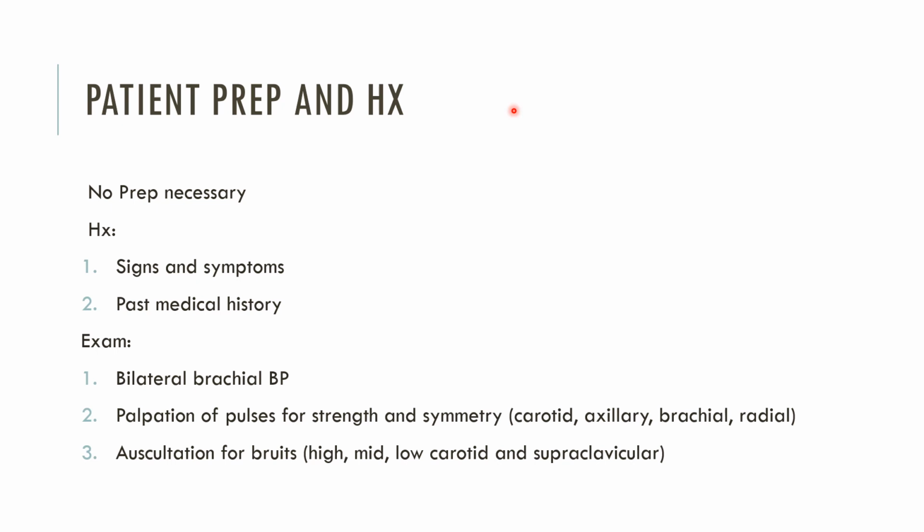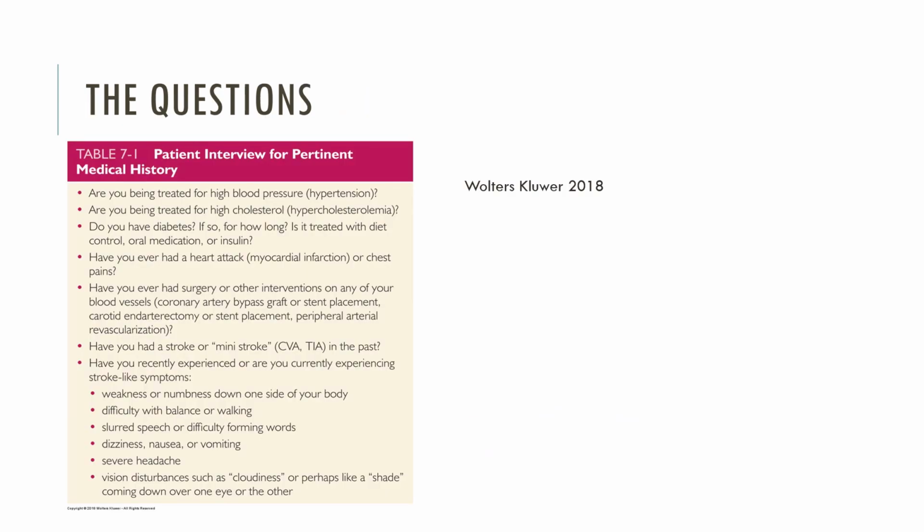One of the best ways to ensure that you're not forgetting anything is to make sure that you have a really good worksheet at your site. And having all of the signs and symptoms questions that you want to ask your patient, as well as their medical history, and then having a place to record your blood pressures, pulses, and auscultation. All of those will help you remember to complete all of these and get that full picture before you start scanning your patient.